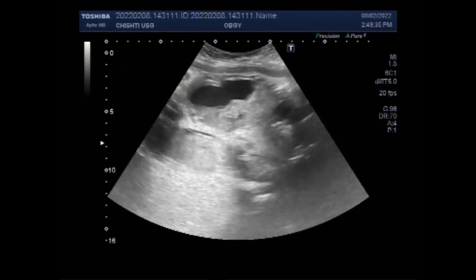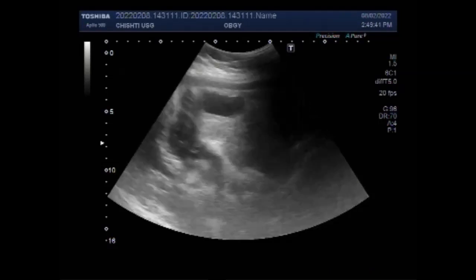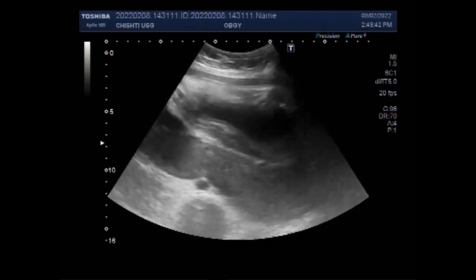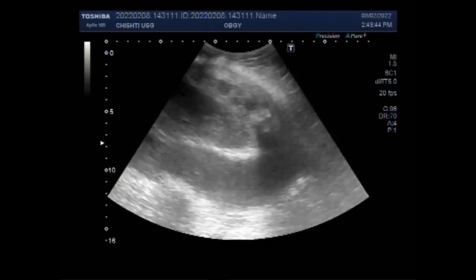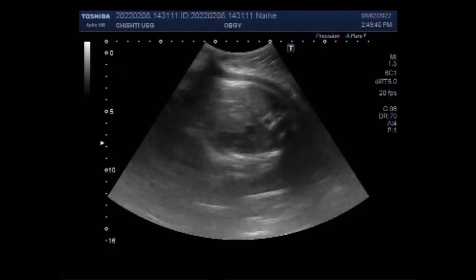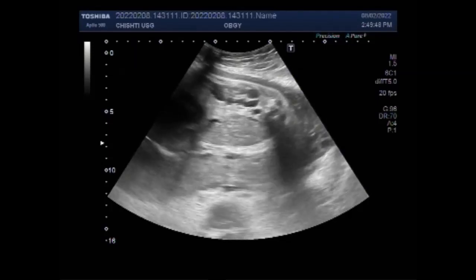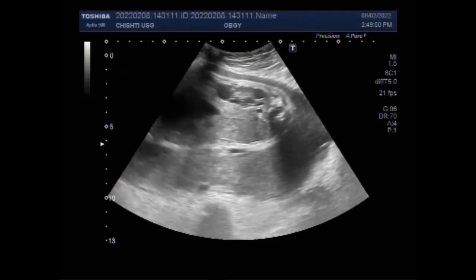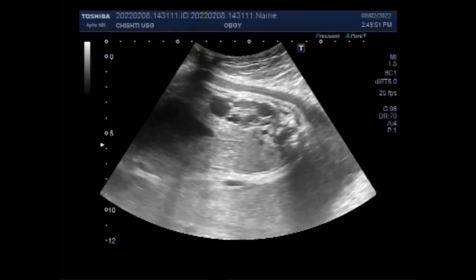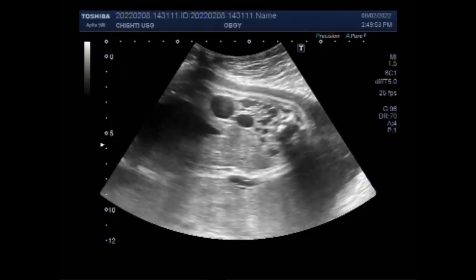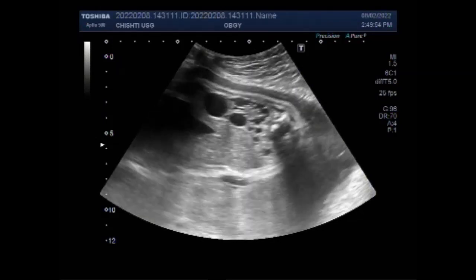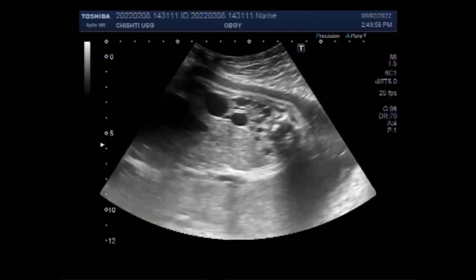The other kidney is shrunken. Now you can see again the fetal urinary bladder and the cystic kidneys of the fetus. You can see multiple cysts — this is cystic disease of the kidney.